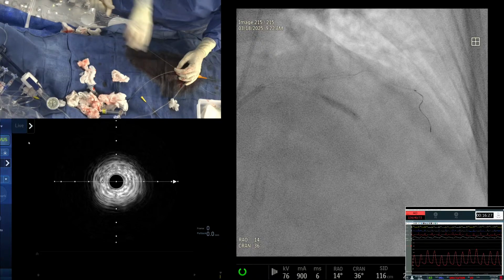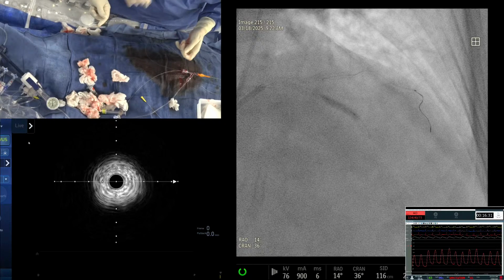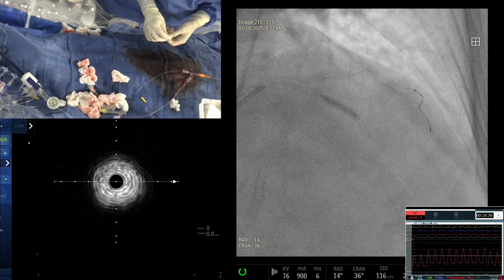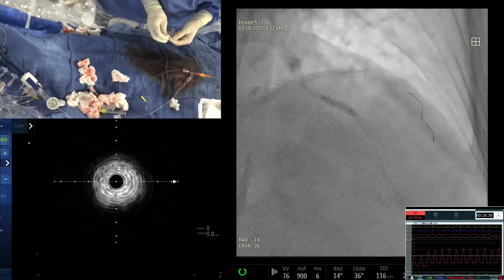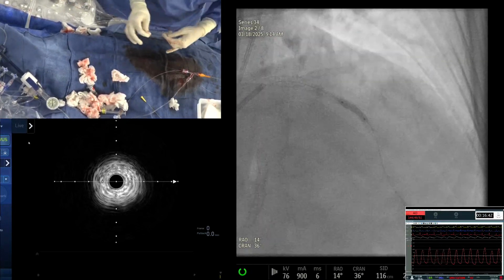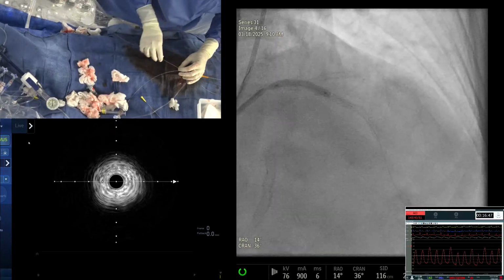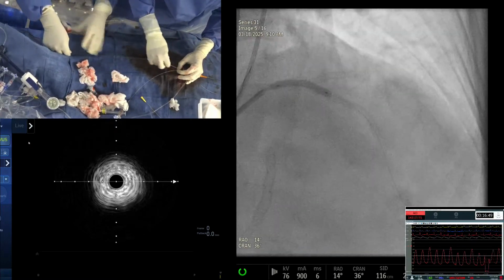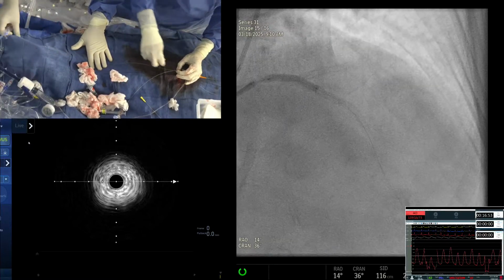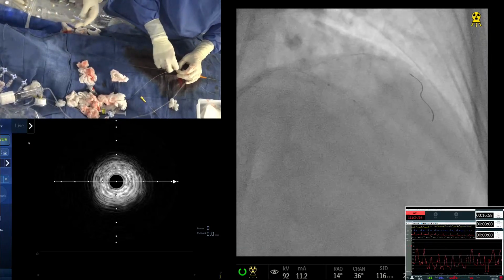What I meant, we have shown so many mini crush in the live case, you can count them. But this is because of the calcium and not being able to modify the calcium the way we had planned. It's not that it's a lot of crush. And you have done the POT also? Yes, up to 4.0, everything has been done by the books. But that's the challenge. So every case teaches us something different. That's life.